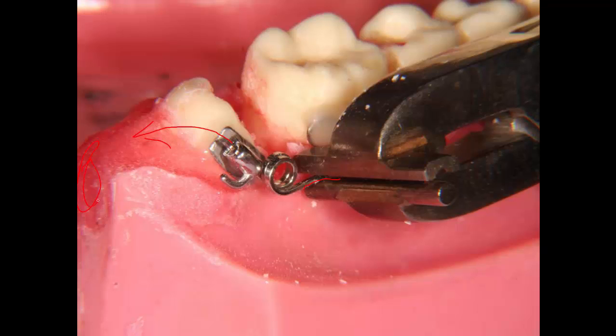And you have wisdom teeth behind them and various things, and they'll still go up. And don't grind the tooth off. If it hits the tooth up above, it'll push it down, and it'll still upright. Leave the tooth alone. Just stick that on it, upright it, and just stay there. The tooth will upright, and it'll be separated from this tooth. It'll be something like in here, and this tooth will come down and contact it and hold it in place, or if it raises up, the tooth will bring it down, or you bring it down after you get it in place and close the space between the two teeth.